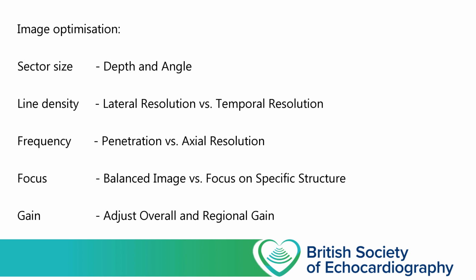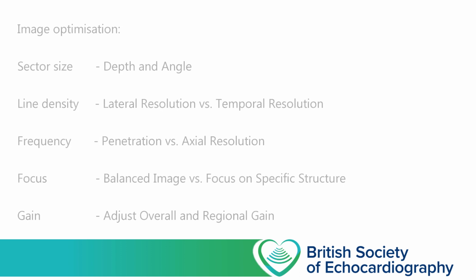Of course, it isn't always possible to produce a perfect image, especially in the sort of patients that are being investigated with a level 1 scan. But if you're able to produce the best image possible in the circumstances, then you've got a greater chance of getting the diagnosis right. Alright, so next up we need to consider artifacts.